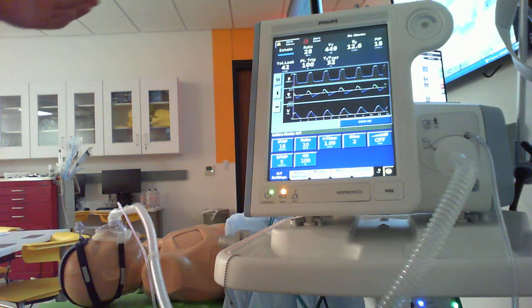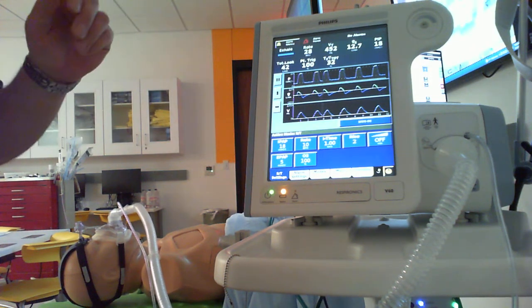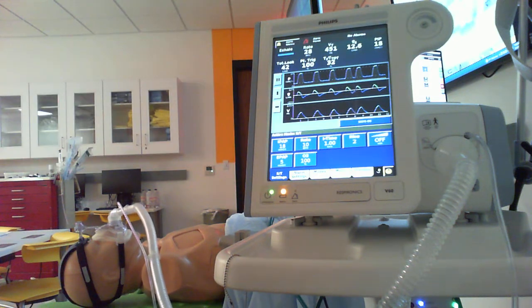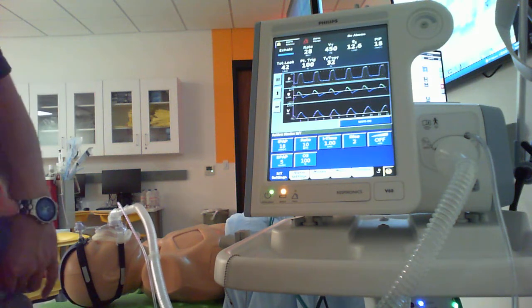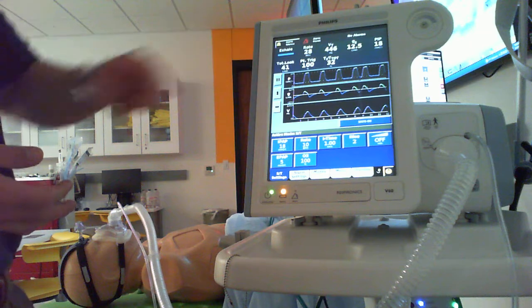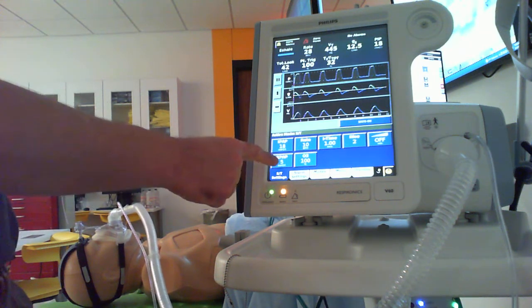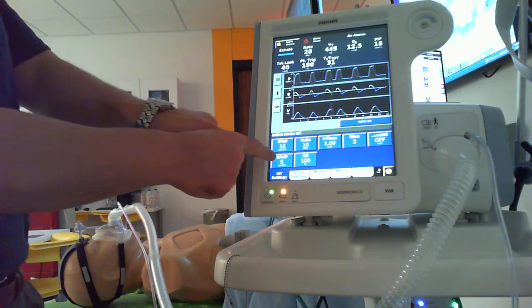If I hadn't done so already, I'd be looking at pulse oximetry and weaning down that patient's FiO2 here. All right. If I wasn't reaching my goal, I would be going up on my patient's baseline. Let's say this patient has worsening pulmonary edema and kind of poor oxygenation, and I'm on 100%. We're going to talk about this more in the application component in class. You can see my patient triggers up to 100% now, so that's good. What would happen? So our only other options to improve oxygenation at this point, okay, would be increasing baseline.